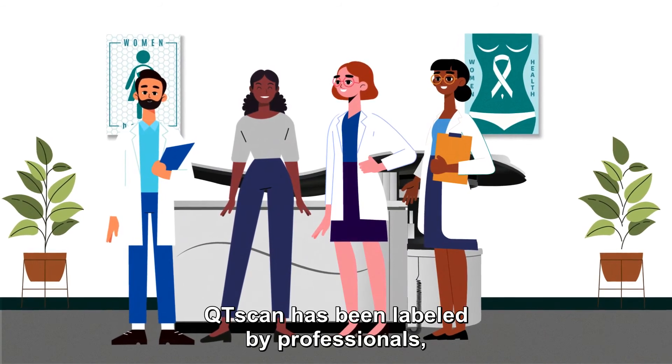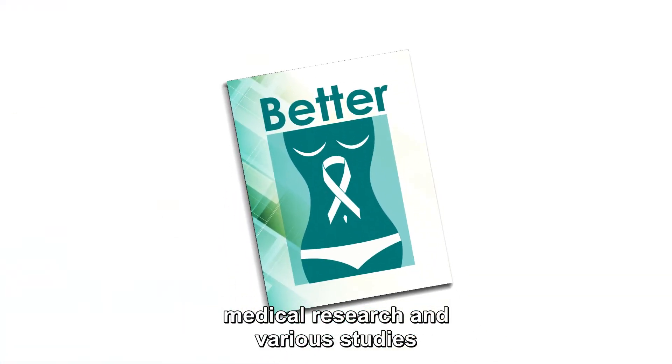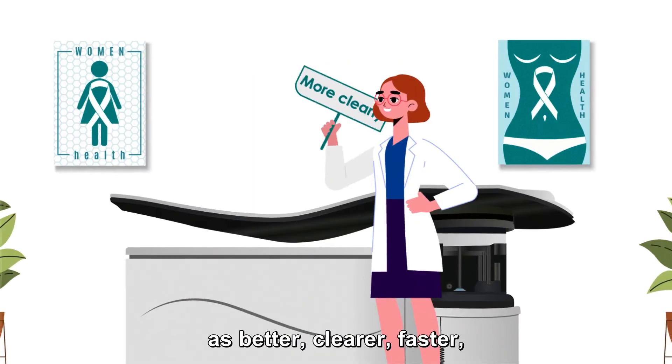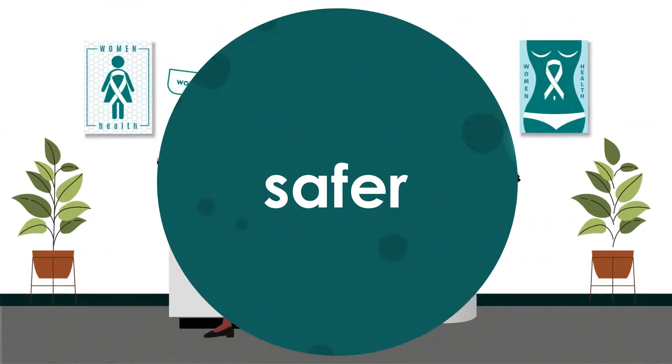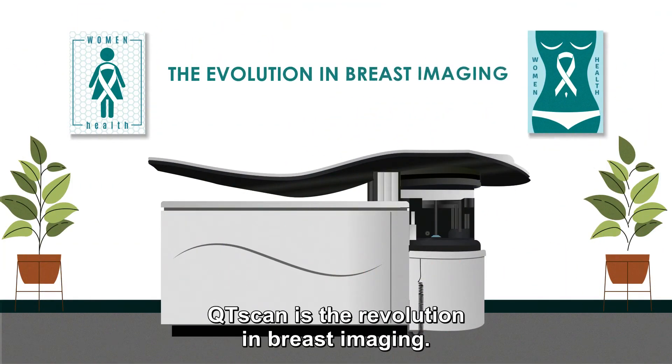QT Scan has been labelled by professionals, medical research and various studies as better, clearer, faster, safer and more woman-friendly than mammography. QT Scan is the revolution in breast imaging.